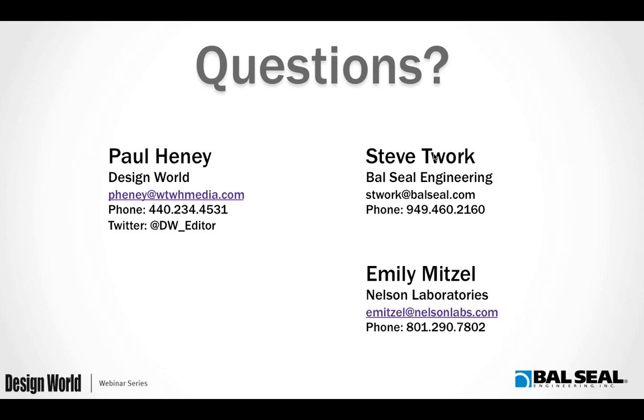Emily, what test soil should be used for a device that's used for eye surgery? So what we would look for is having them explain the surgical procedure to us exactly. And from the testing that we've done previously on instruments similar to that, the majority of what the devices would go through is more of a mucus type of solution, and we have an exact test soil that mimics a mucus solution.